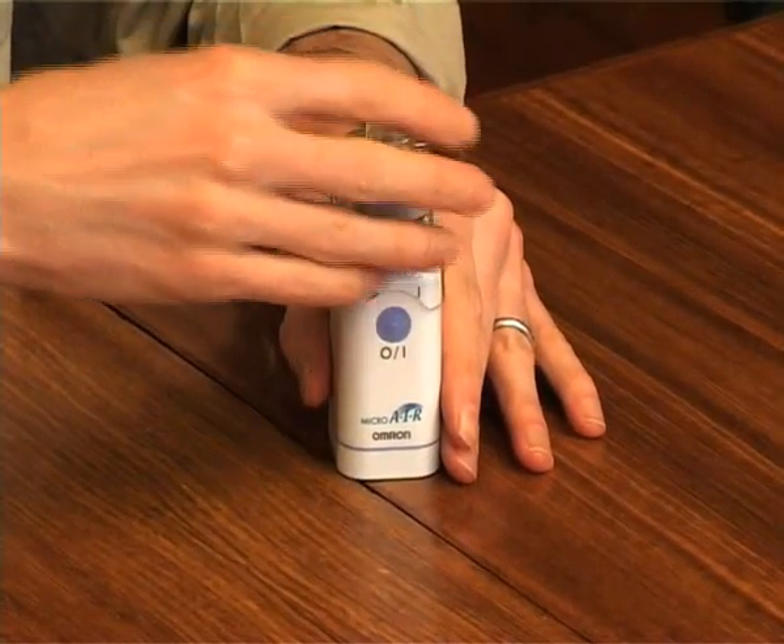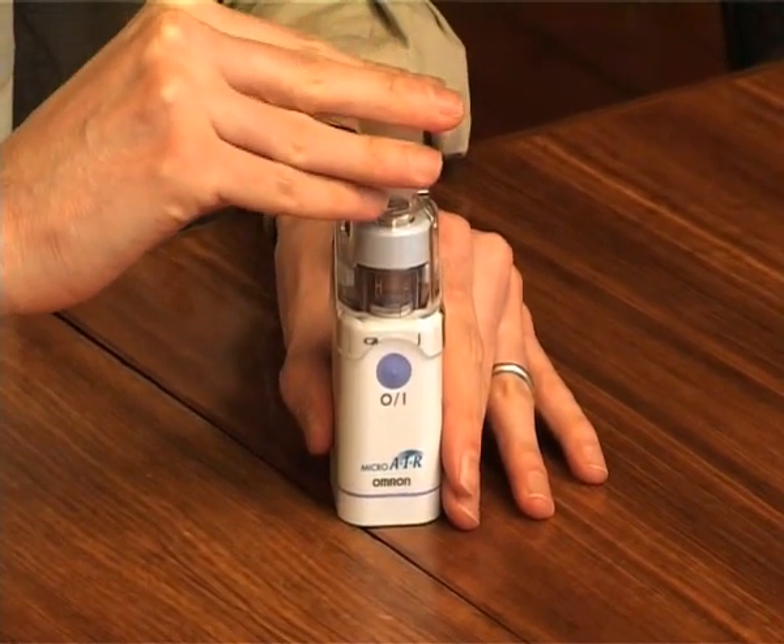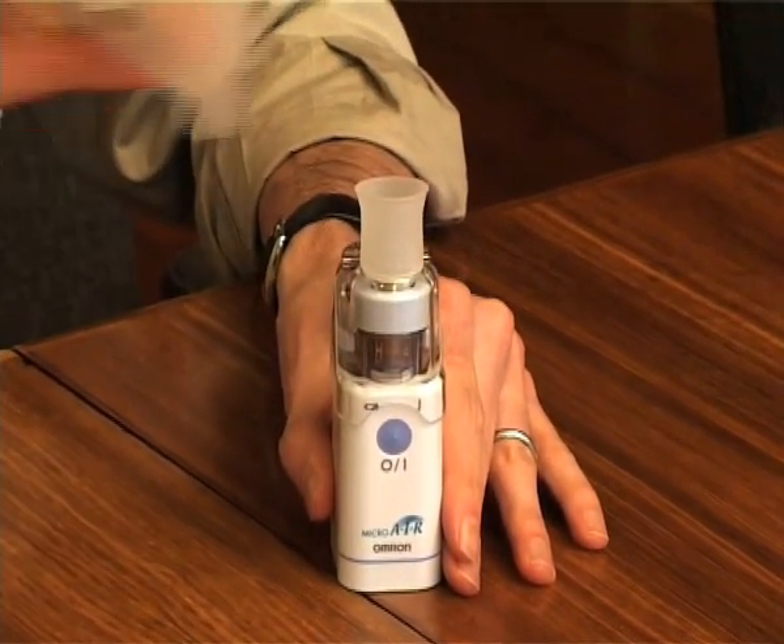Install the mask adapter and the inhalation mask or the mouthpiece. Installation is now complete.